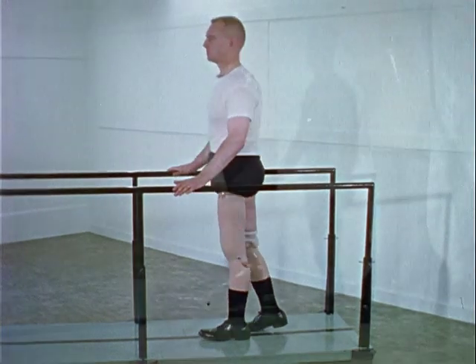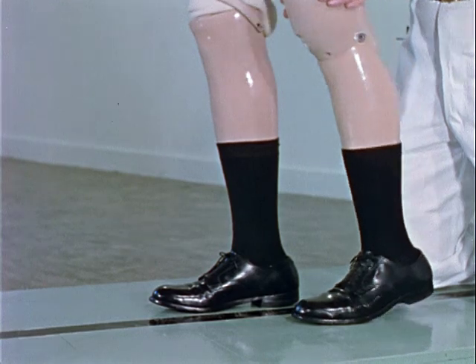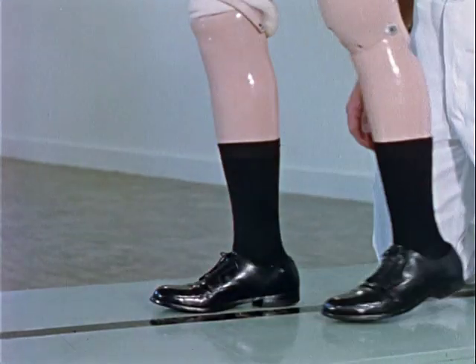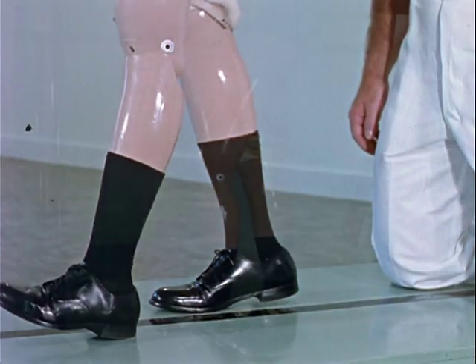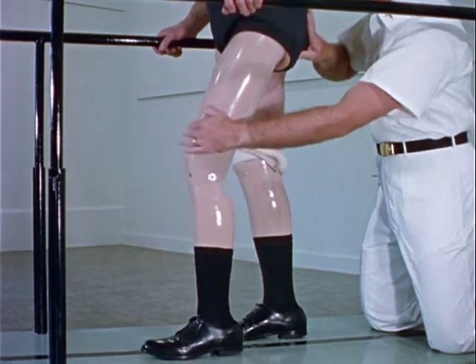In using the above-the-knee prosthesis, the patient must learn two basic skills. First, he must learn to swing the prosthesis and time the swing so that complete knee extension comes just at heel strike. Second, he must learn to lock the knee joint by extending the hip.